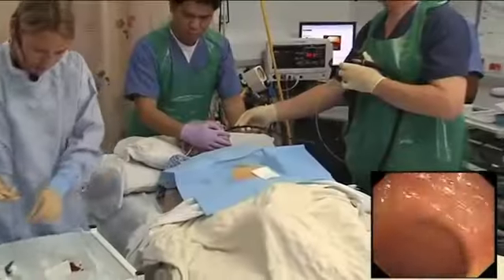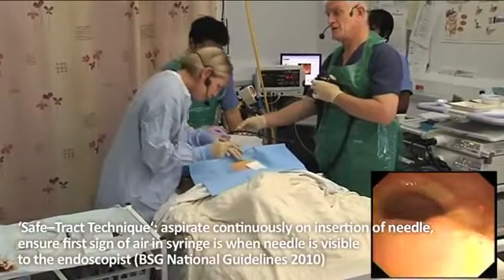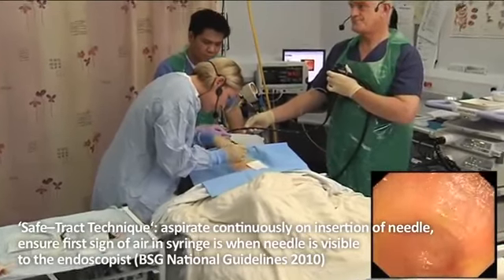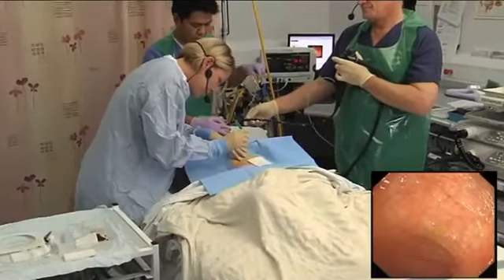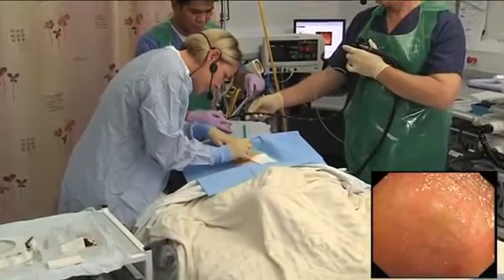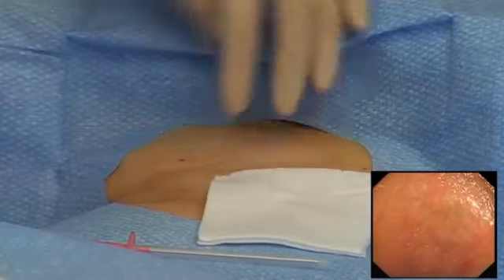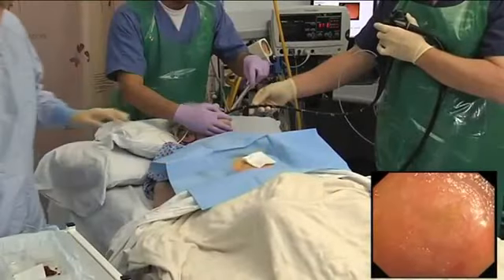Yep. What we're going to do is just put the scalpel through now. And this scalpel is actually the same size as the 16 French tube, so it only needs to go down once. And that's the right size for the tube.